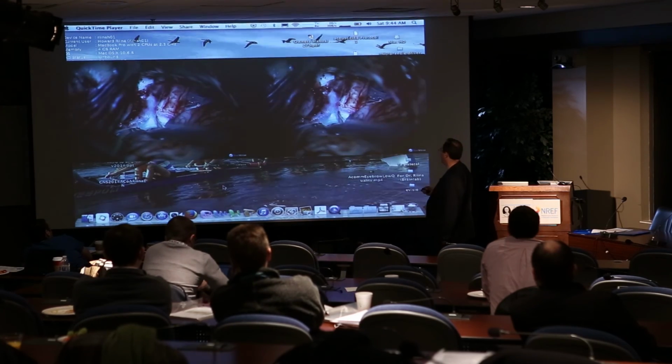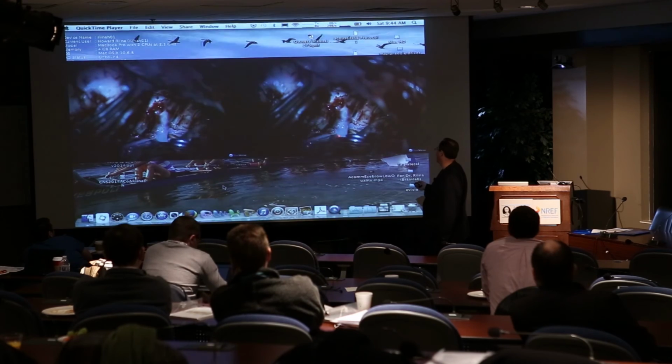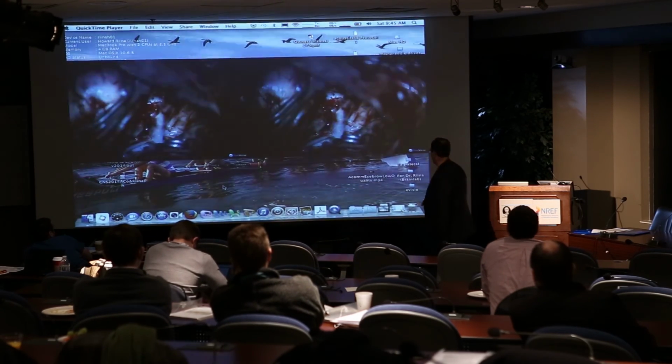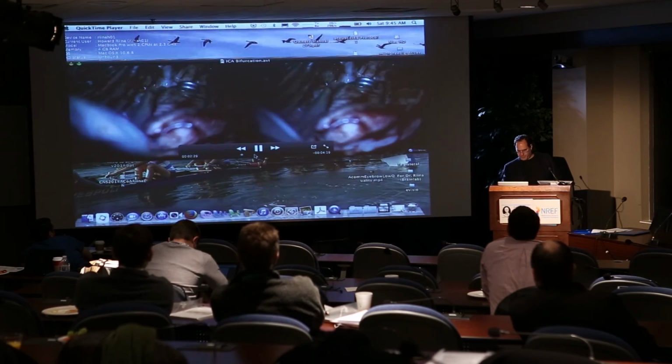Okay? And so I'm cinching it down, and without doubt, you can see as I close the clip, I'm kinking the vessel there, kinking the M1. And that's not good. We know there's not going to be good flow there. So let's move it along a little bit.